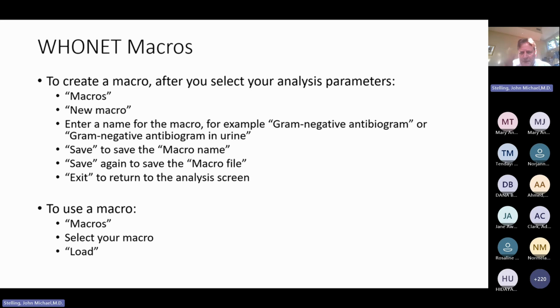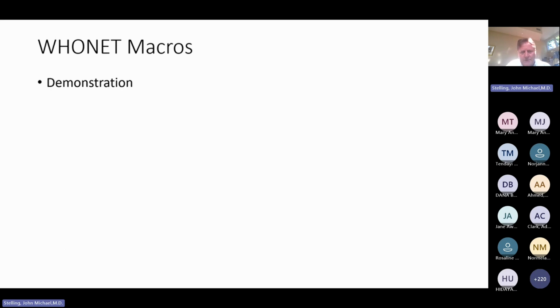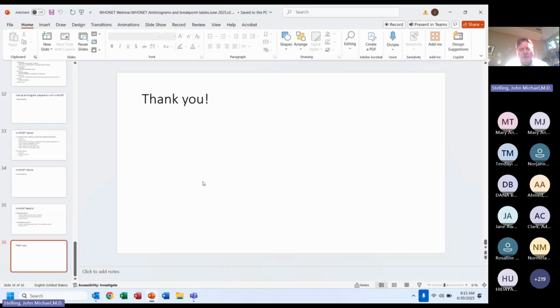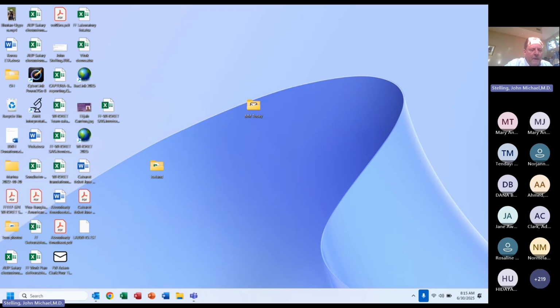How do you make a macro? It's in the slide presentation, but I'll show it to you live instead. And the demonstration of the macros, WHONET standard reports in Word and/or Excel, user-defined reports. So now let me get to the live presentation.